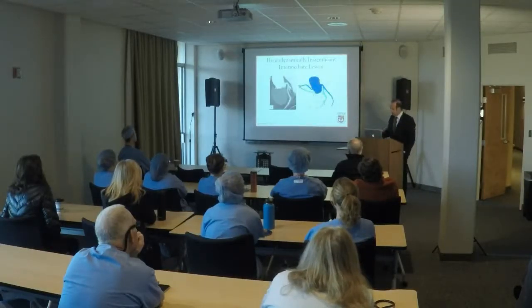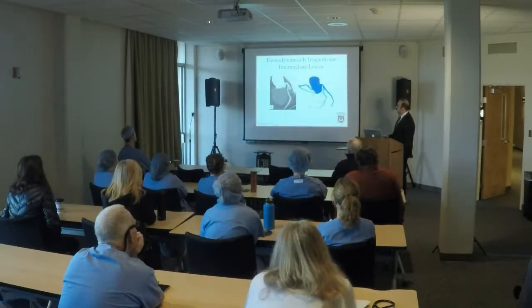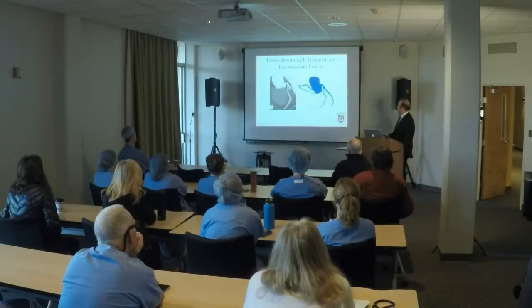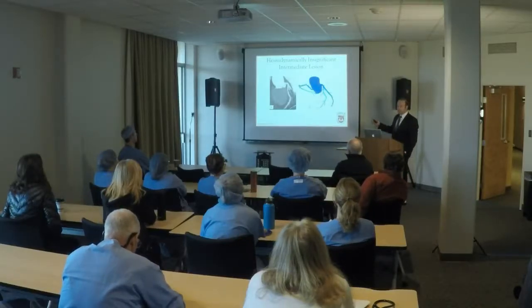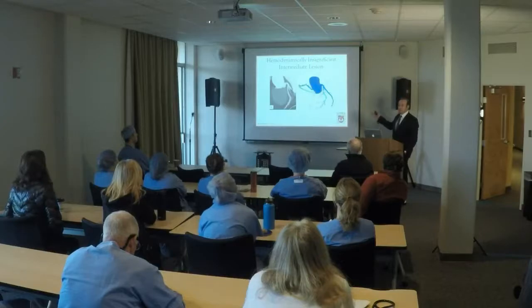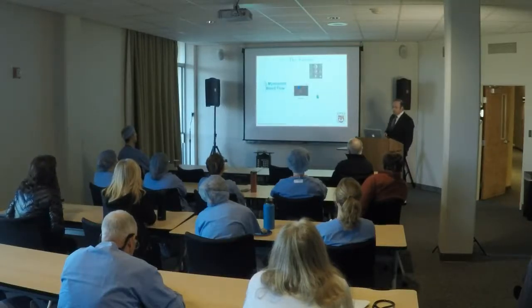at follow-up. This is one of my patients that I've been following for over 3 years now. Prox LAD lesion here. Again, around 50 to 70% diameter reduction here. The FFRCT was negative throughout the LAD. This patient was safely deferred an invasive angiogram, and as I said, I've been seeing her for over 3 years now, and she's doing just fine on medical therapy. So safe cancellation of downstream cath.